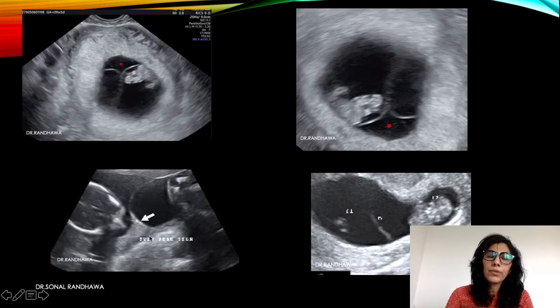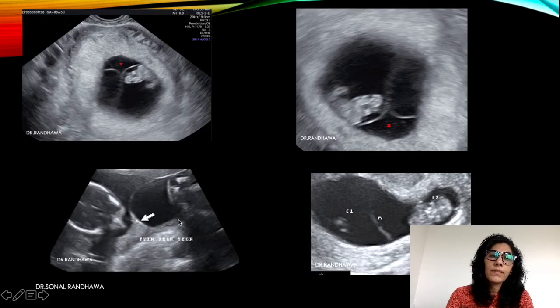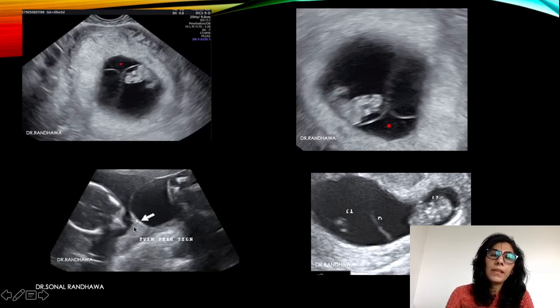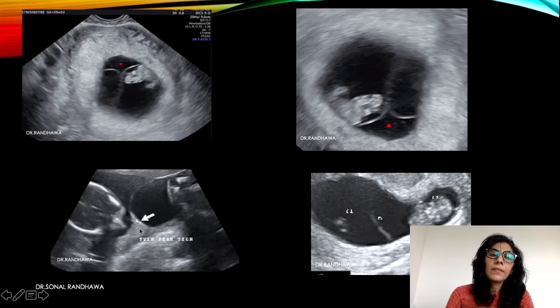This sign is seen when the placentas are close together or fused. Why is the lambda sign formed? In dichorionic diamniotic pregnancies, there are two chorions and two amnions. The chorion and amnion from each placenta fuse together, leaving a gap in between. In this gap, placental villi grow and that forms the twin peak or lambda sign.